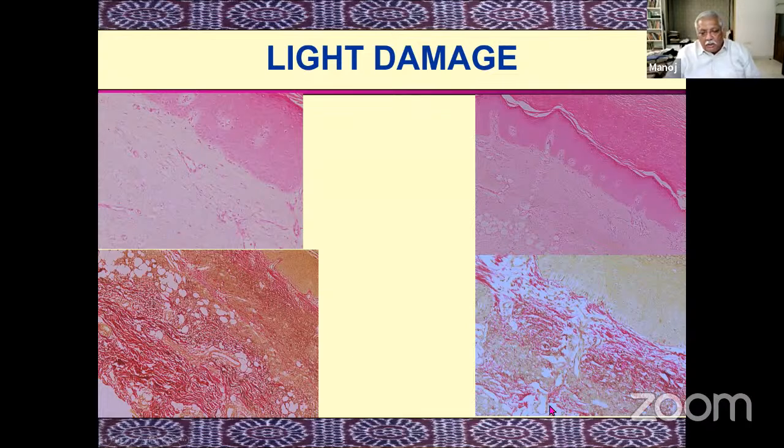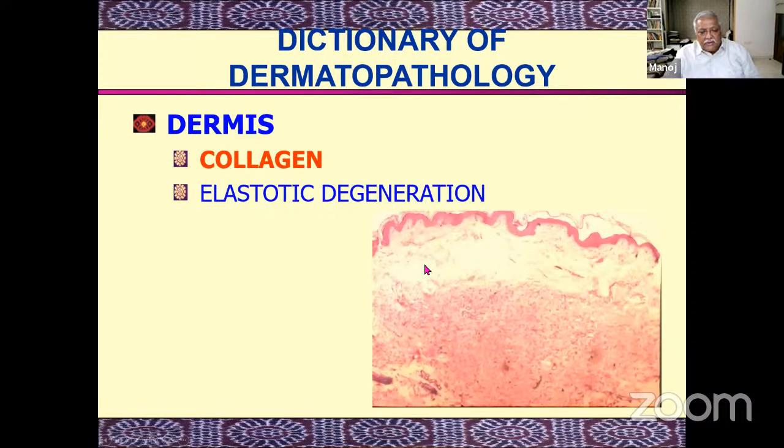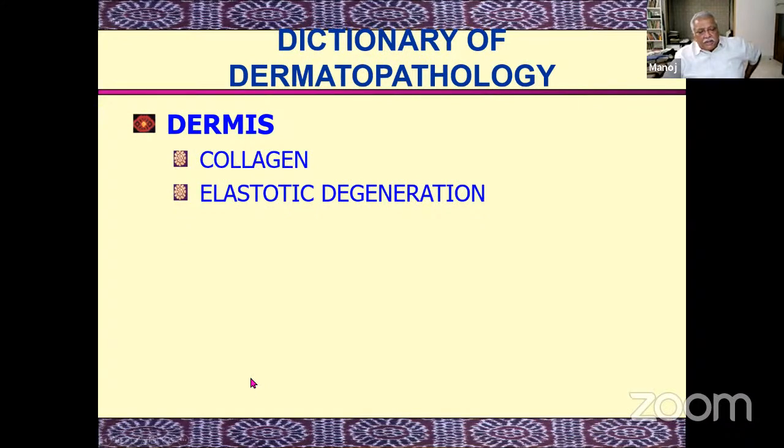And when you do a special stain, you can make out that the collagen structure is breaking up. Show you in another case. You can make out here normal collagen and hyalinized collagen. Again, the same, a special stain showing you normal and absent or deficient or problematic. Now, this is an elastotic stain called a VVG, Verhoeff-Van Gieson. And you can make out here that the elastic fibers here are relatively normal, here absent. Again, these could be some congenitally derived conditions, or it could be light damage.